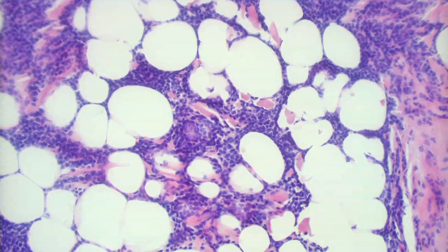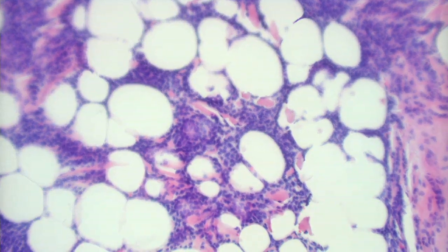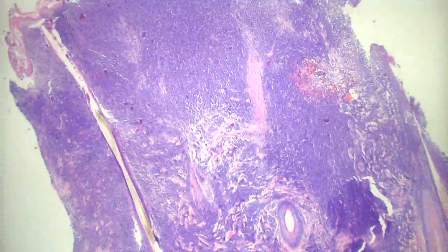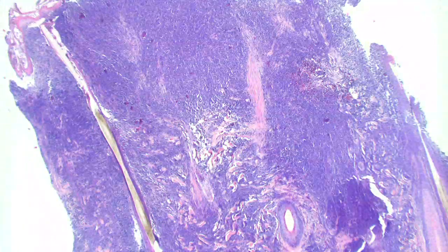So this was tumor stage mycosis fungoides. That's what it looked like clinically. So obviously not a good situation for the patient when they get that. So just remember, this pattern is really great for lymphoma. I'm not sure if the board would expect you to know this was MF, but they might expect you to realize that all this epidermotropism favors that versus a B-cell lymphoma. B-cell lymphomas sometimes give you follicles, like follicle center cell lymphoma, so you don't see that in the T-cell lymphomas as commonly.